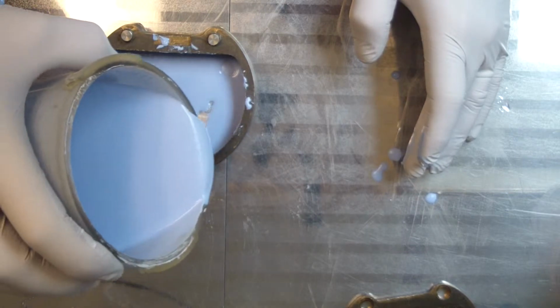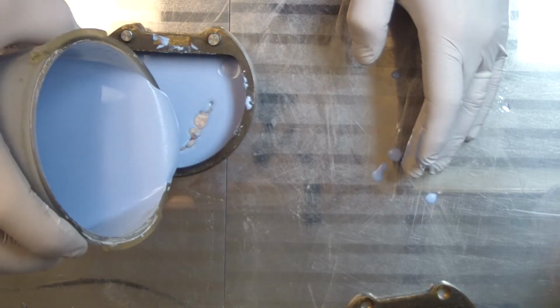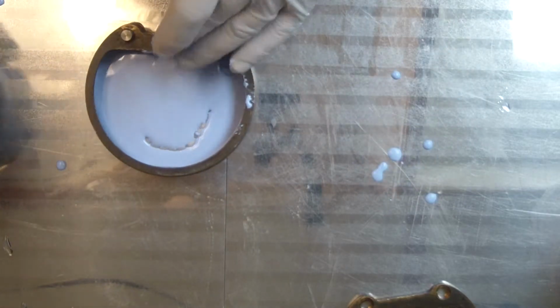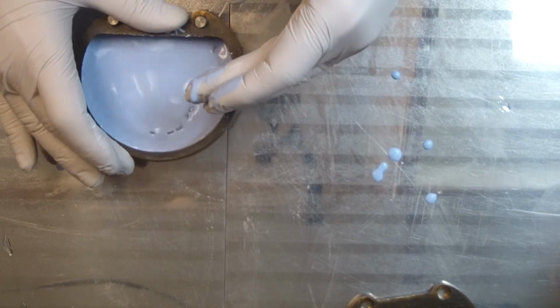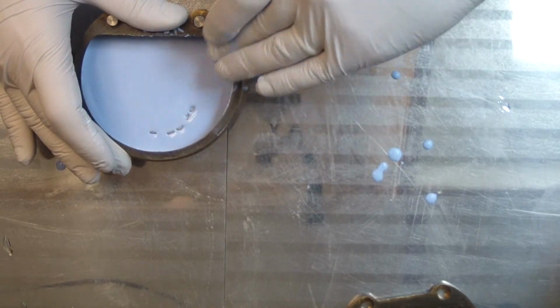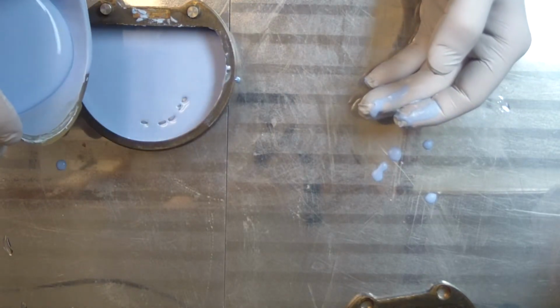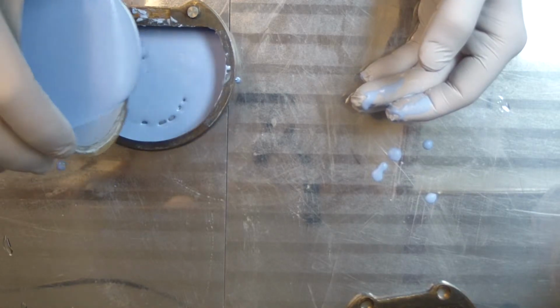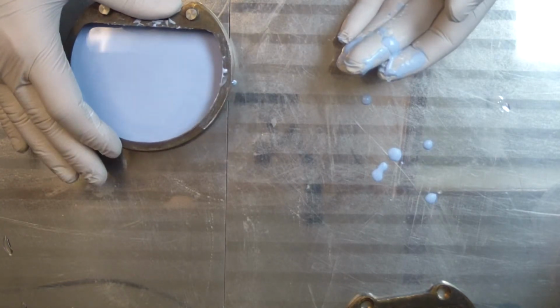Go all the way around on the facial and go a little bit on the lingual. And shake it a little bit more. This way it's a little bit more work, and you don't have to do it this way, but to me I feel more confident that the case will turn out better if I make it in this way.